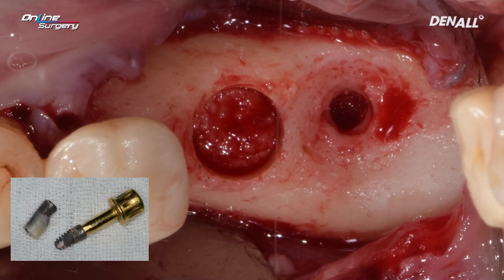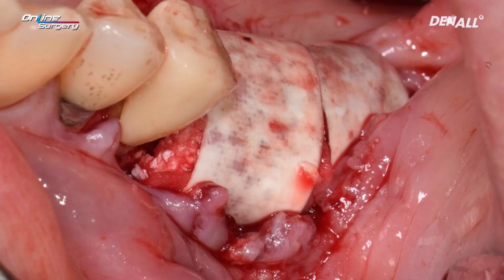First, the implants were all explanted. The vertical bone defect was severe, so GBR was done to recover it. Non-resorbable membrane needs to be used for the treatment to recover vertical deficiency. And I believe that is the right approach, but in this case, the soft tissue contour was not really good.